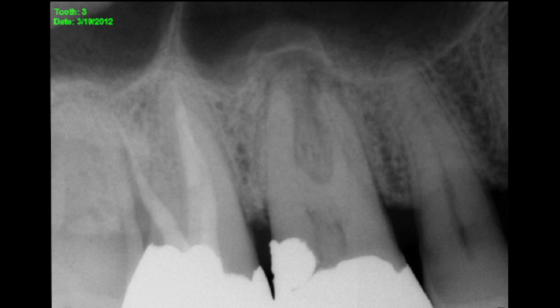Hi, my name is Terry Pancook. I'd like to share this interesting maxillary first molar. This is the preoperative radiograph. The roots do not look distinct like a normal radiograph. The buccal roots are very thin and narrow with sort of a double image.